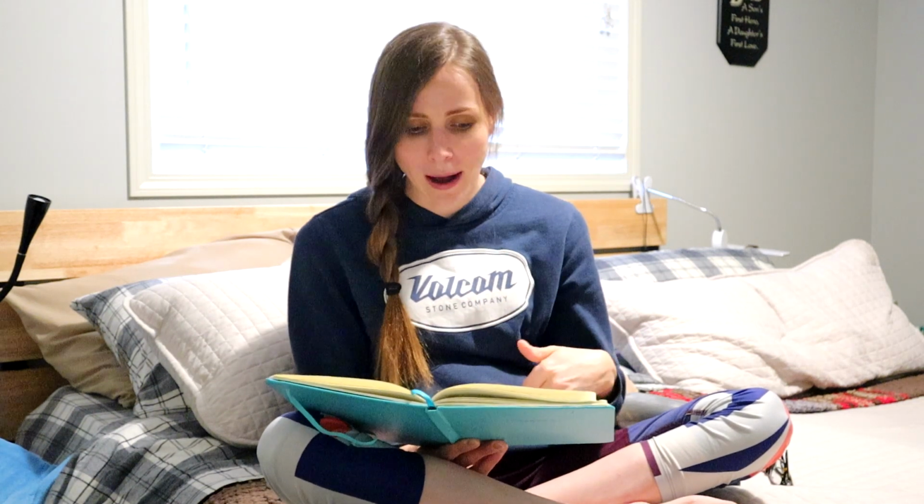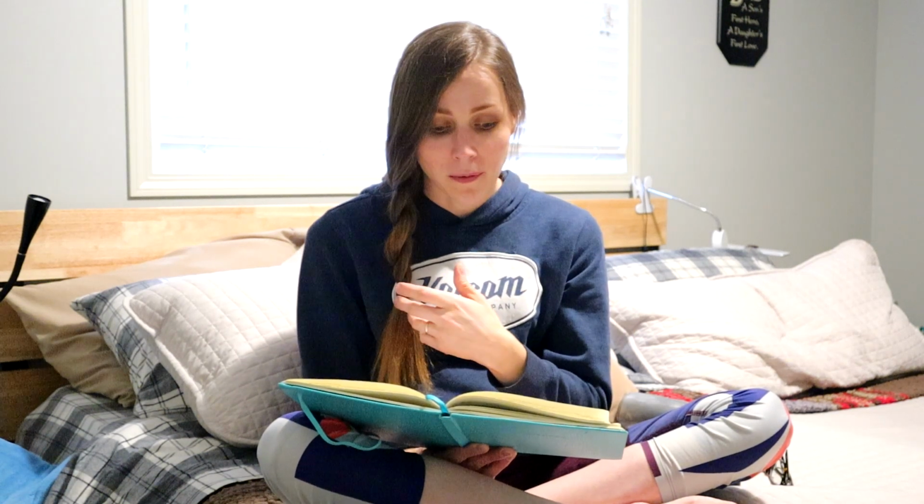So benefits of a suprapubic catheter is less UTI risk. Just in general, where the catheter is actually going in is farther away from the bacteria that are in your perineal area. So there's just less chance of those kinds of bacteria traveling up the catheter because it's on your abdomen and not near your butt. And then it's easier to manage for people that have limited hand dexterity or sensation.